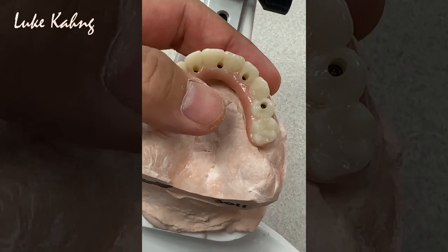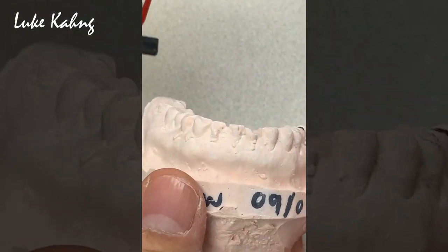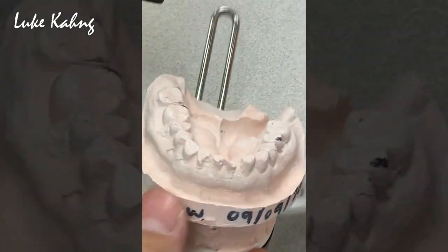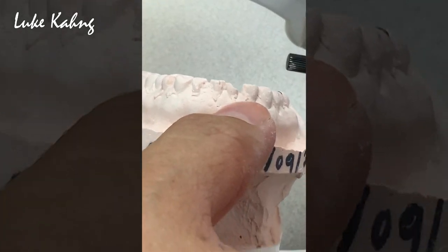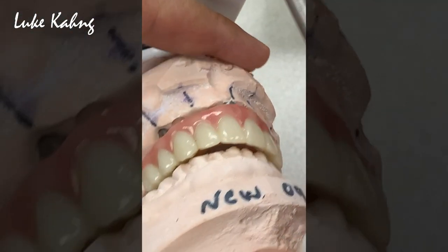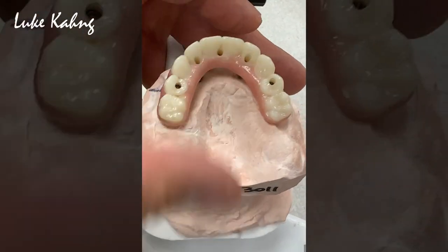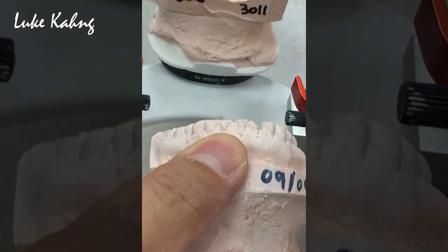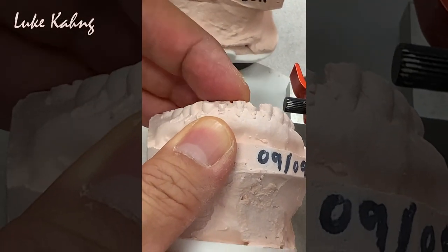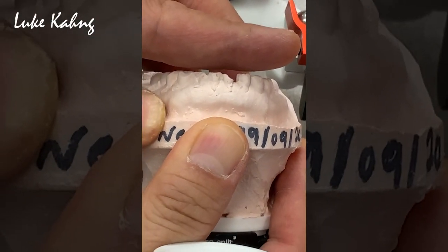I need all occlusion contacts touching. Either raise this, and probably the patient doesn't have any money, but this one they have to change. At least they have to make a temporary with acrylic, whatever. And then we can build this one better so that we get all the occlusion contacts together. Simple. We have to add here, either bring it in lingually, and add this. That's my recommendation. Eventually they need this. These are really low teeth. Whenever they have money, then we have to increase this much height.